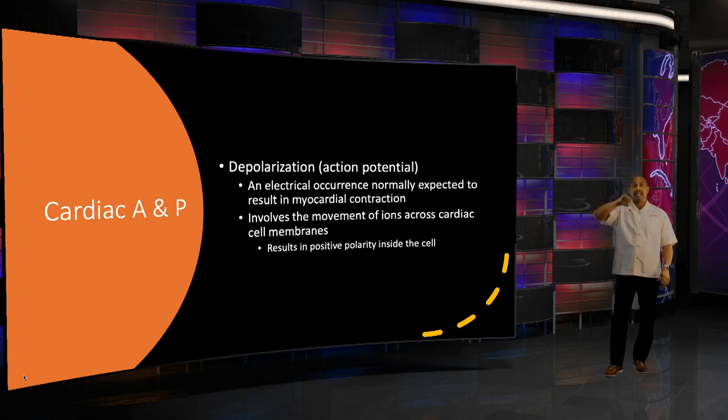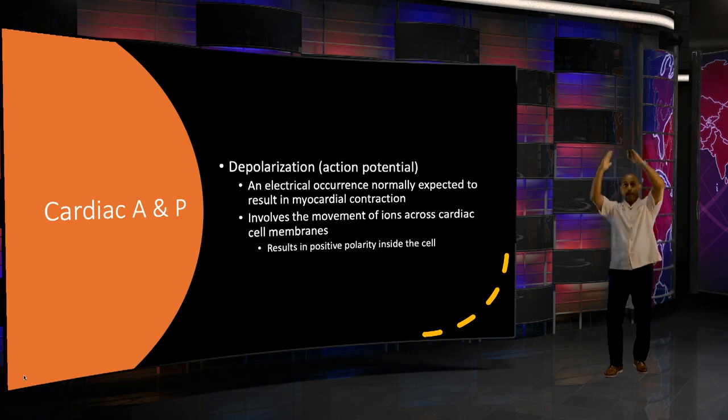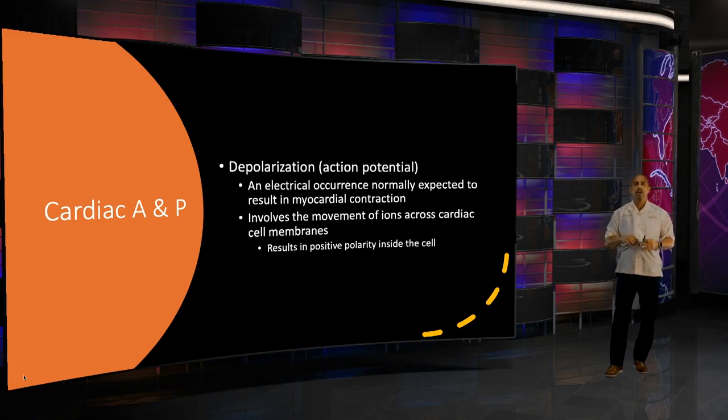The more potassium, the more notching, the higher it becomes. The less potassium, well, the less we'll see that notch. Okay, so that's that phase that we're going to see. All right, so we know a lower notch is, well, less repolarization. A higher notch, a lot of repolarization, meaning more potassium. So, it's going to really be hard when you have a lot of potassium for these sodium channels to repolarize, so sodium could come back in and depolarize.